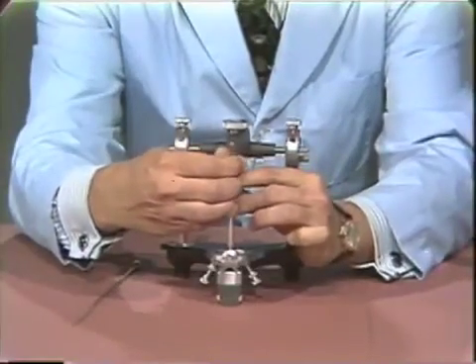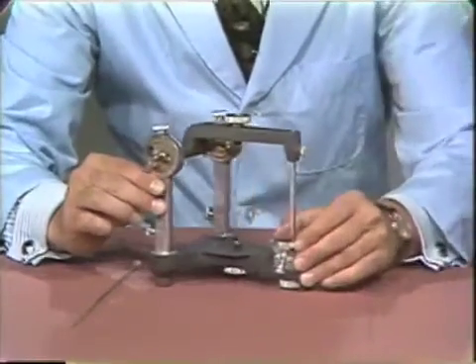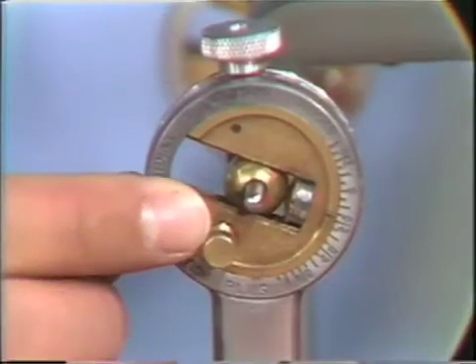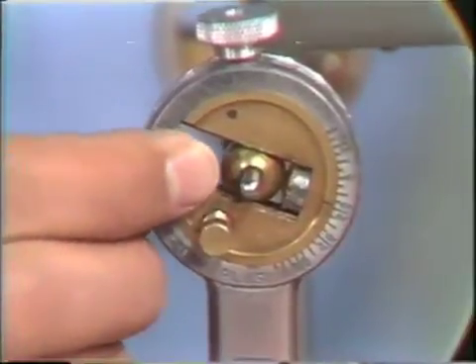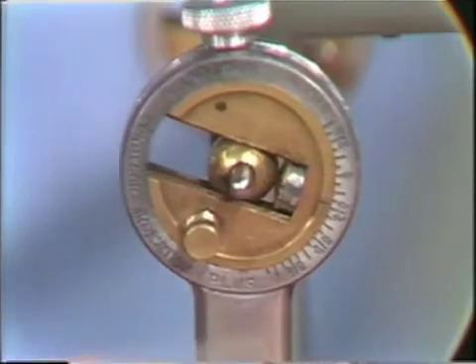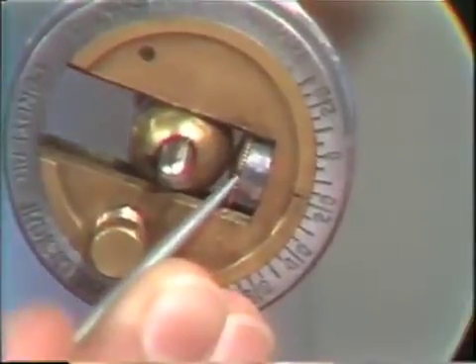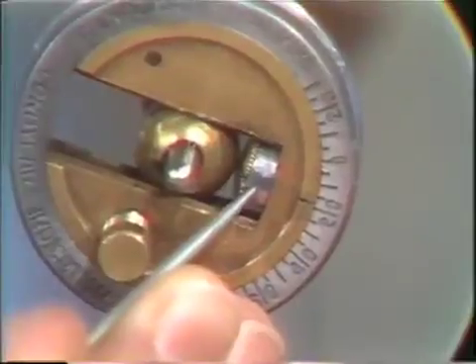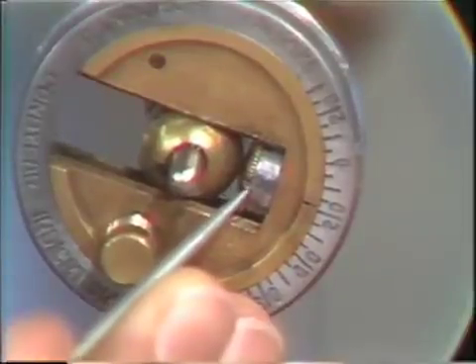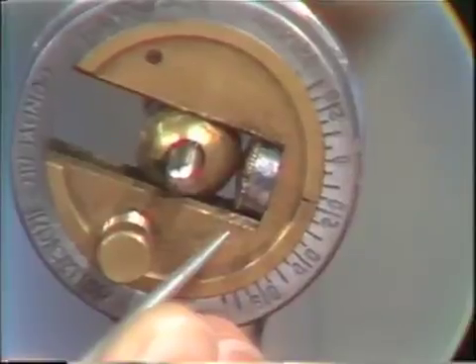Returning the pin to its flush position, we focus our attention on the condylar element of the articulator. When the condylar element is in its proper starting alignment, the condylar ball should be against the centric stop thumb screw — this brass thumb screw — and a cylindrical spacer should lie in front of it. The reading on the undersurface of the thumb screw should read zero millimeters on the protrusive-retrusive calibration.